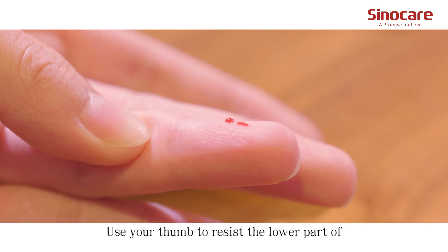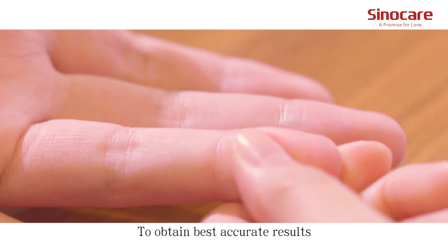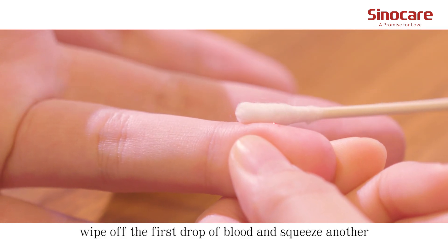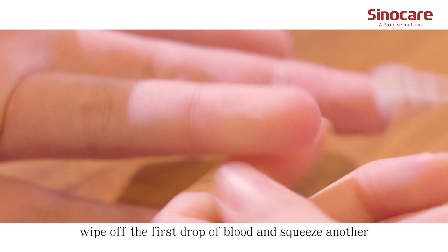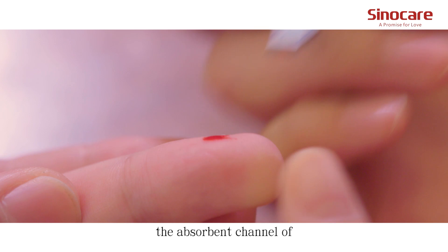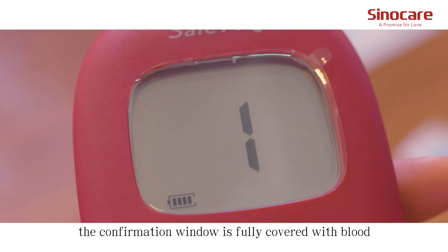Use your thumb to resist the lower part of the puncture site to help draw blood. To obtain the best accurate results, wipe off the first drop of blood and squeeze another. Apply the blood sample to the opening of the absorption channel of the test strip until the confirmation window is fully covered with blood.